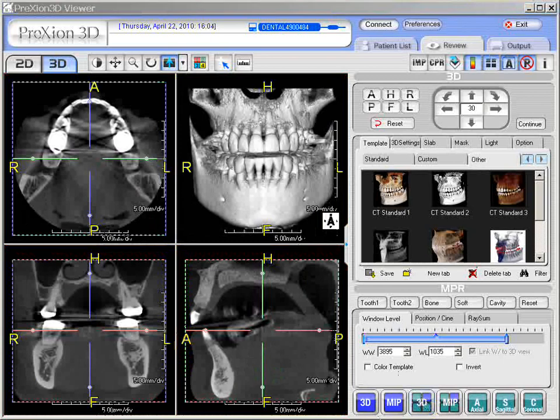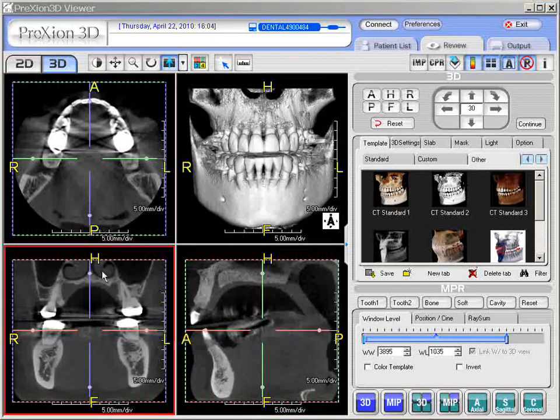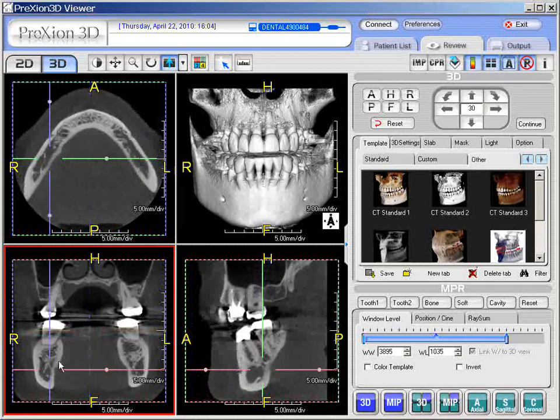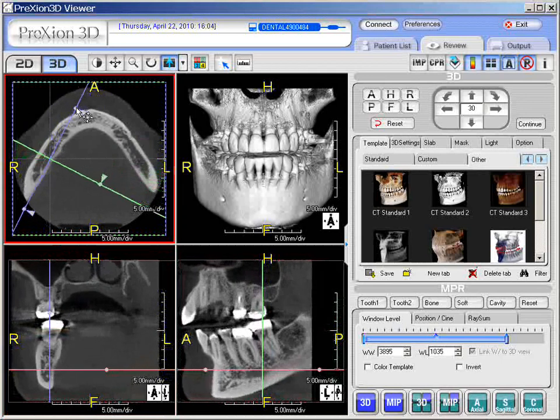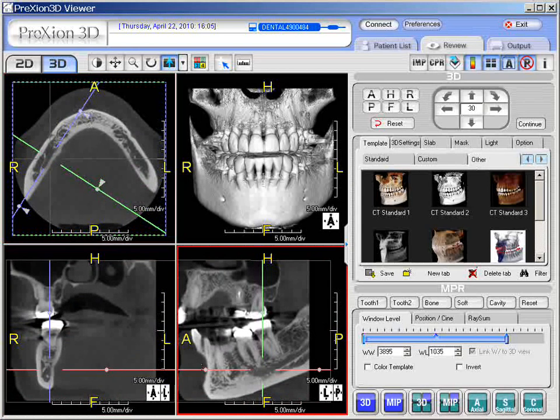Here's an excellent way of adjusting the crossbars and lining them to a section that you wish, lining all three views into one section. The crosshairs in the middle of the colored lines can be adjusted. The easy way is to hold the Alt key next to the space bar on the keyboard. Here is the mandibular canal on the right mandible. Once we select it — notice the caliper — I'm putting it right over the mandibular canal and I'm going to left click it into position. Then I go up to the axial plane. In the vertical blue line, there is a circle called the anchor point. From the anchor point, I'm going to left click my mouse and drag this line parallel to the right side of the mandible. Looking in the sagittal projection, you can see the mandibular canal coming up very nicely.